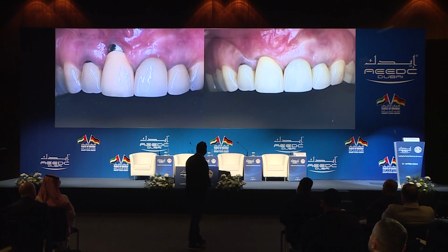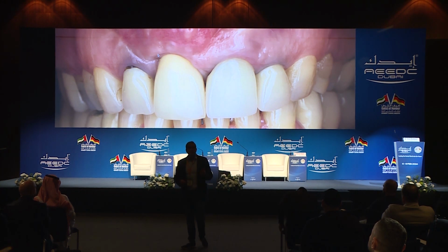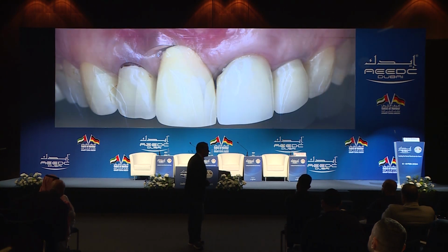This is a few months healing time, and this is almost 2 years healing time. So in one surgery, we were able to save this patient the hassle and treatment, 6, 7 appointments, and money. And this is where we started, and this is where we finished.